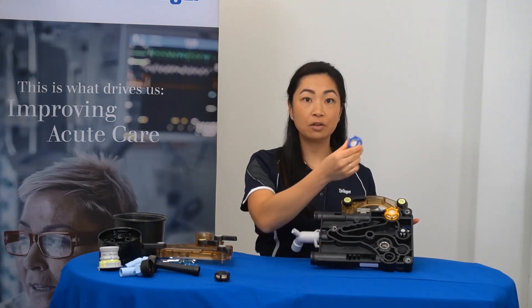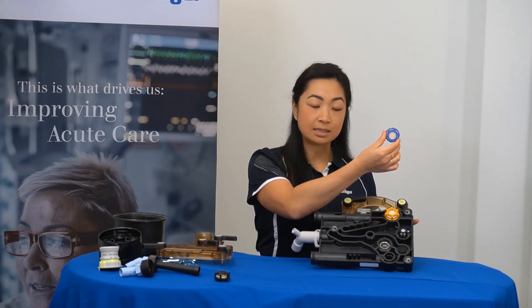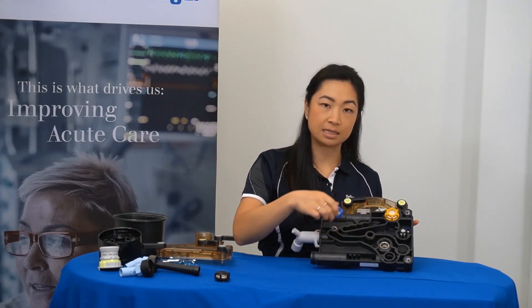With the expiratory valve, you'll notice that the notches are at 12 and 6. This will align with the notches in this position here.